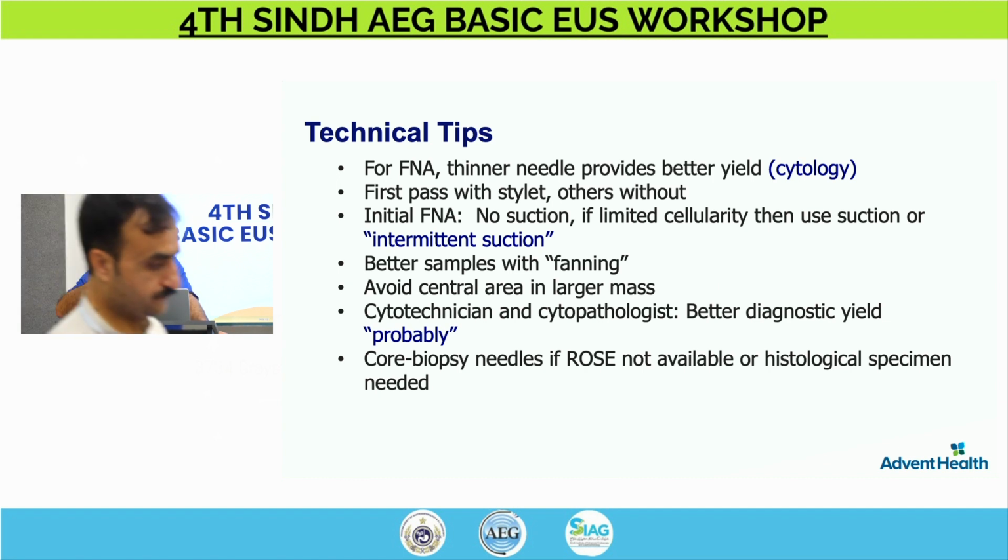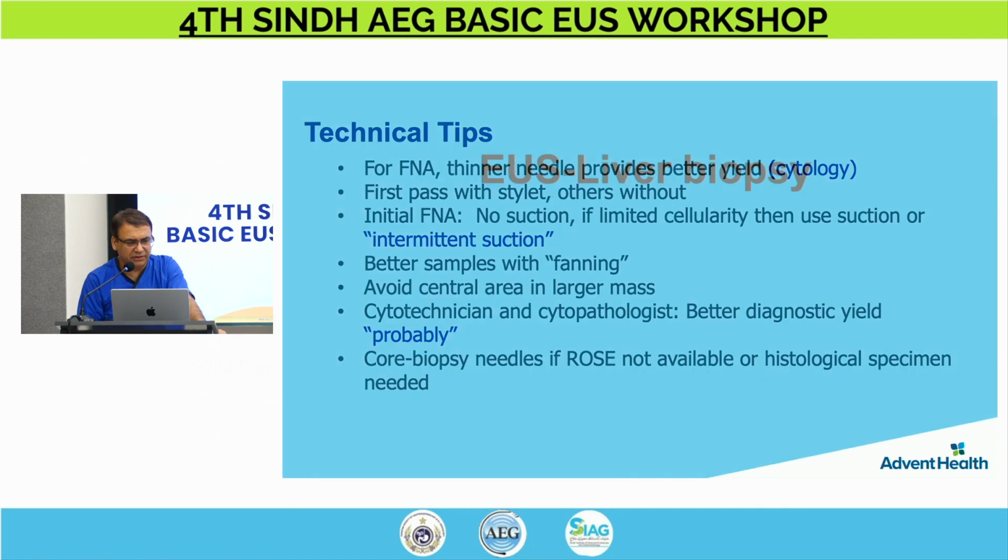But the problem with that is when you have to express the specimen, and especially if you're doing a liver biopsy, it's just going to fragment the whole tissue. And also pushing through that, there's a small chance of crushing the specimen because the needle part would go first into the tissue, and then you are just kind of crushing the specimen inside the needle. But that is available.